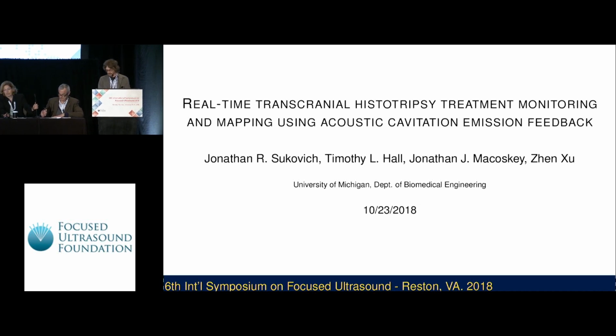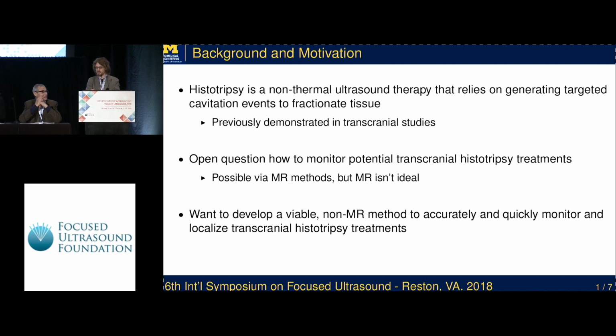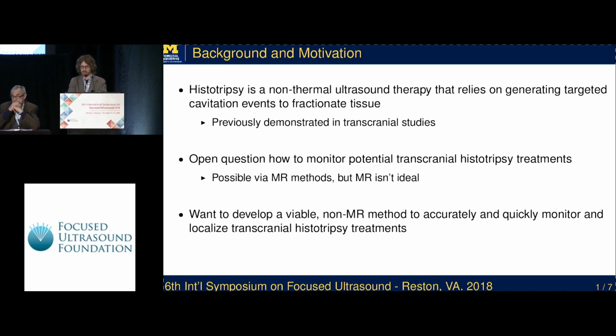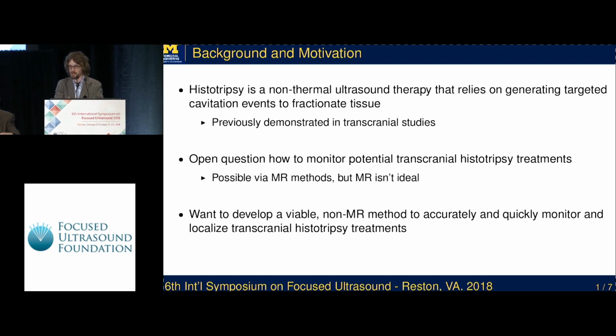All right, thanks. So that's what I'll be talking about today. A little bit of background and motivation for this. Histotripsy, as most of you know, is a non-thermal ultrasound therapy that relies on generating targeted cavitation events to fractionate tissue. We've previously demonstrated in transcranial studies that we can target accurately to within a millimeter of the focal spot that we intend to, and that we can treat large volumes rapidly. We've achieved treatment rates of up to about 10 cc's per minute.